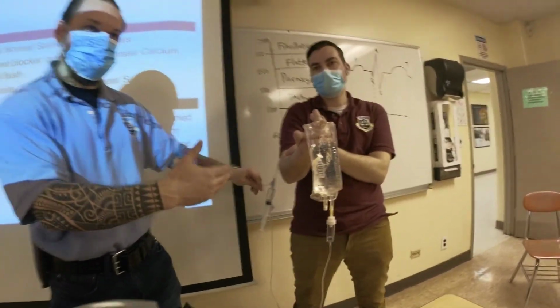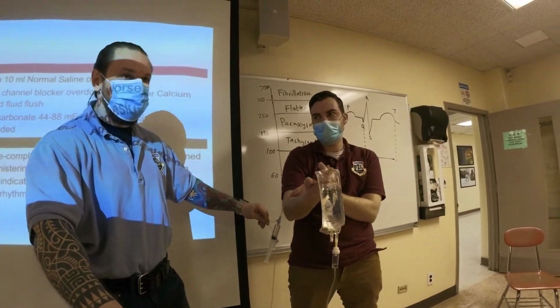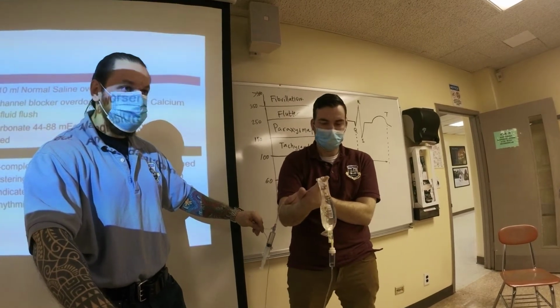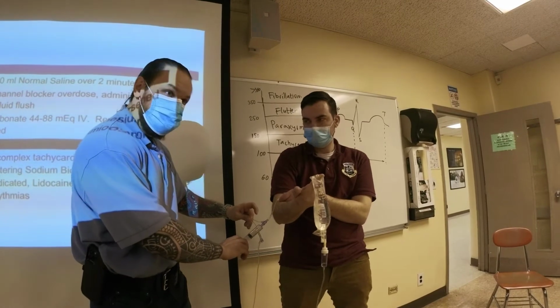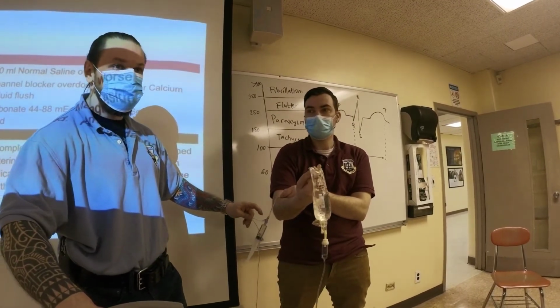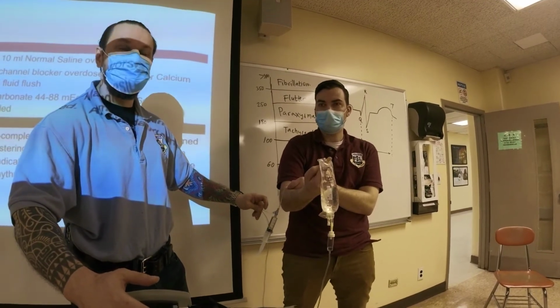Obviously, the patient's not going to be standing. And it's a good idea if your partner is there. You want to already hook up, right? You want to make sure you have your pads available, and you want to have your 12 leads available. Why? Because once I administer this medication and it takes its effect, let's say I see a change in my rhythm, I see a change from torsades to any other rhythm, I want to do a 12 lead EKG. Why do I want to do a 12 lead EKG?